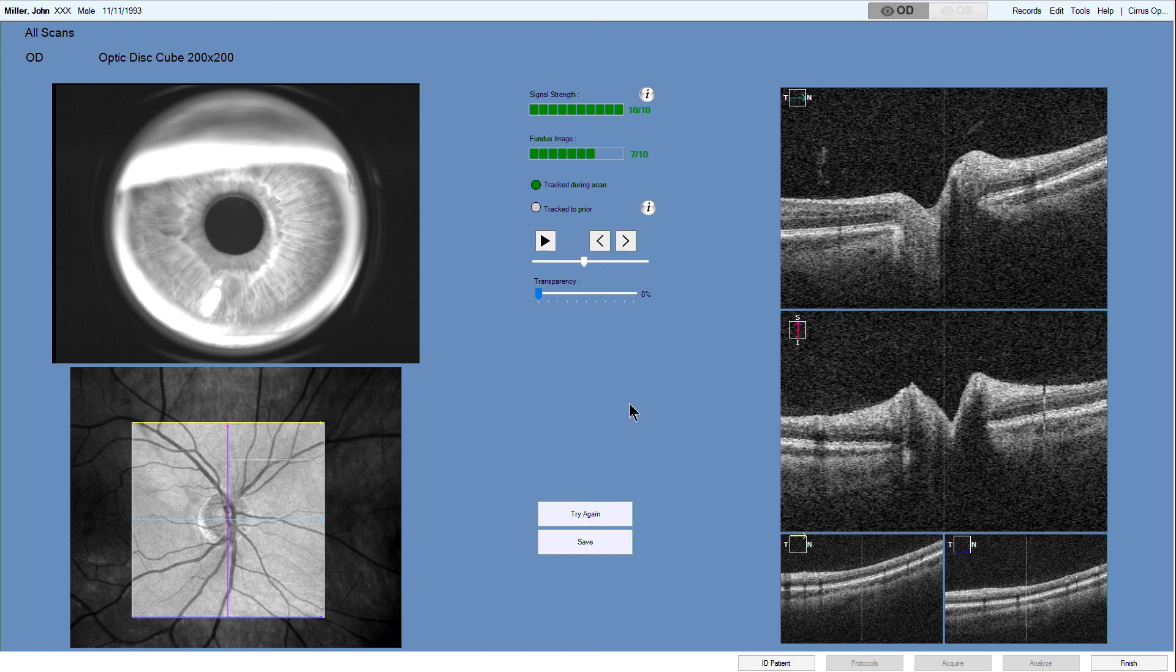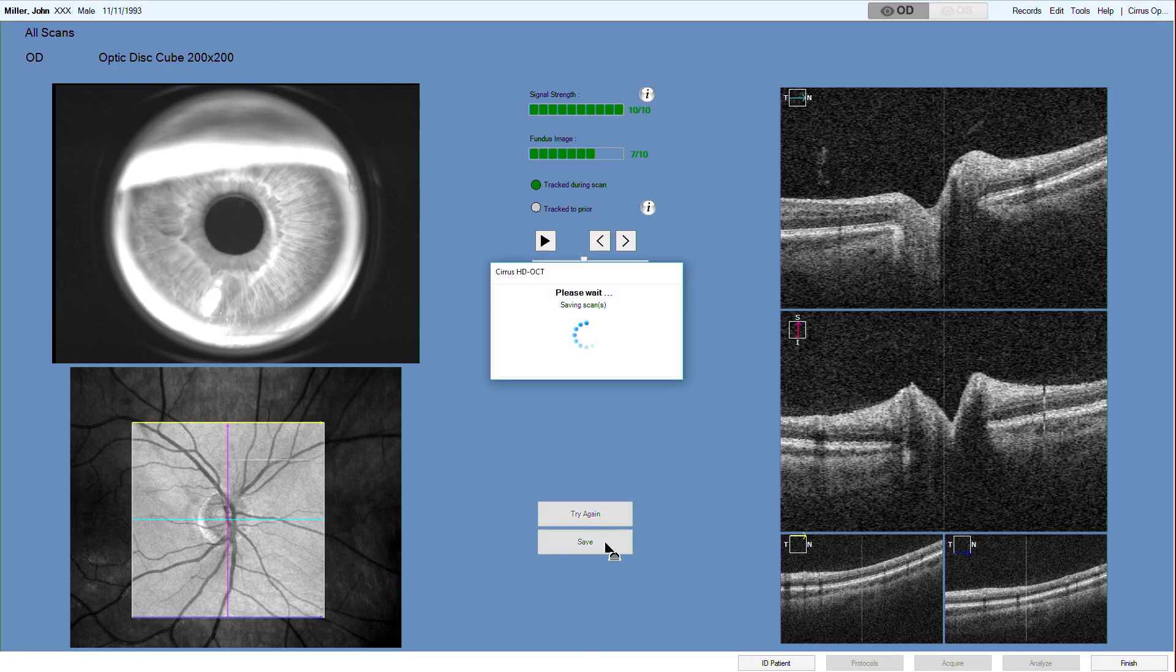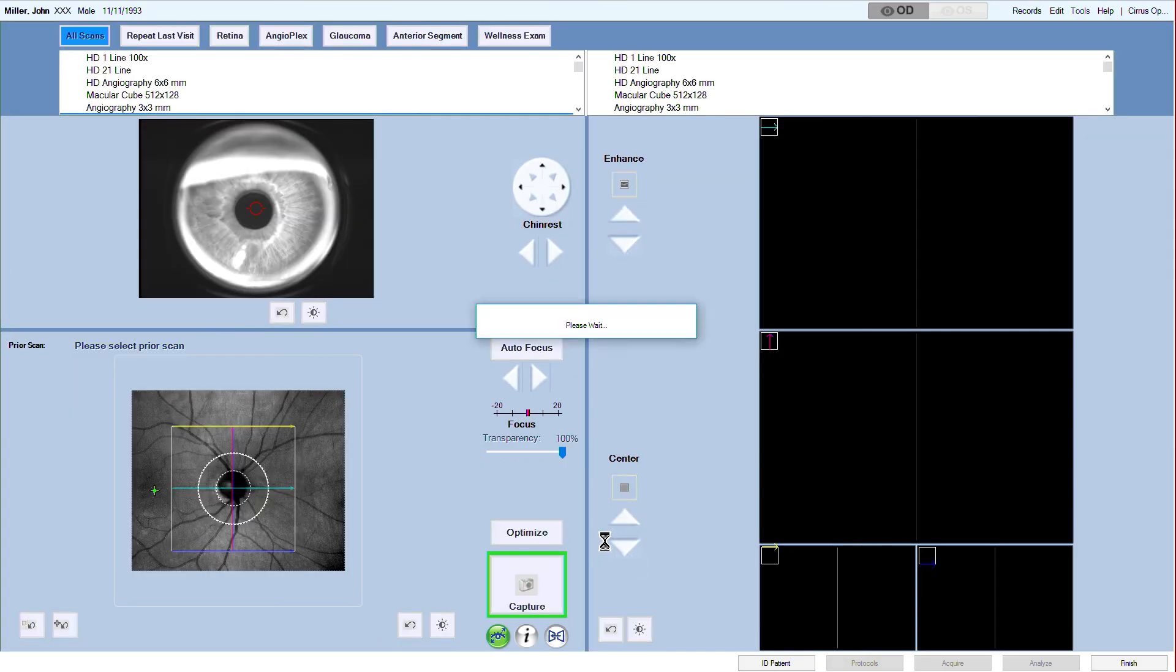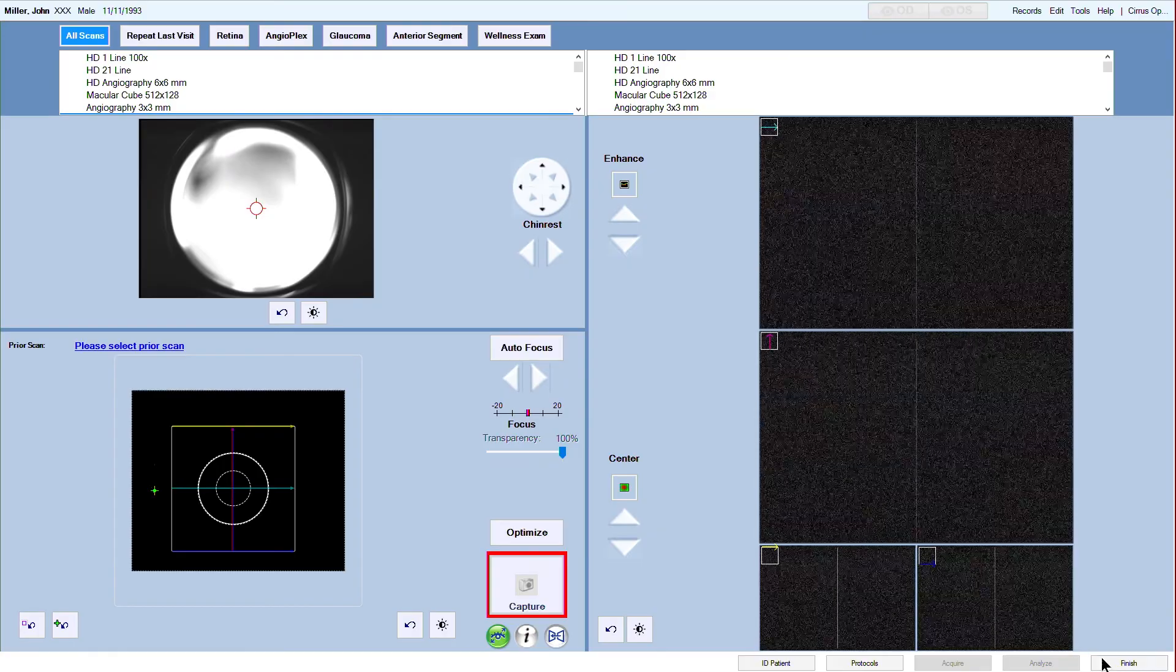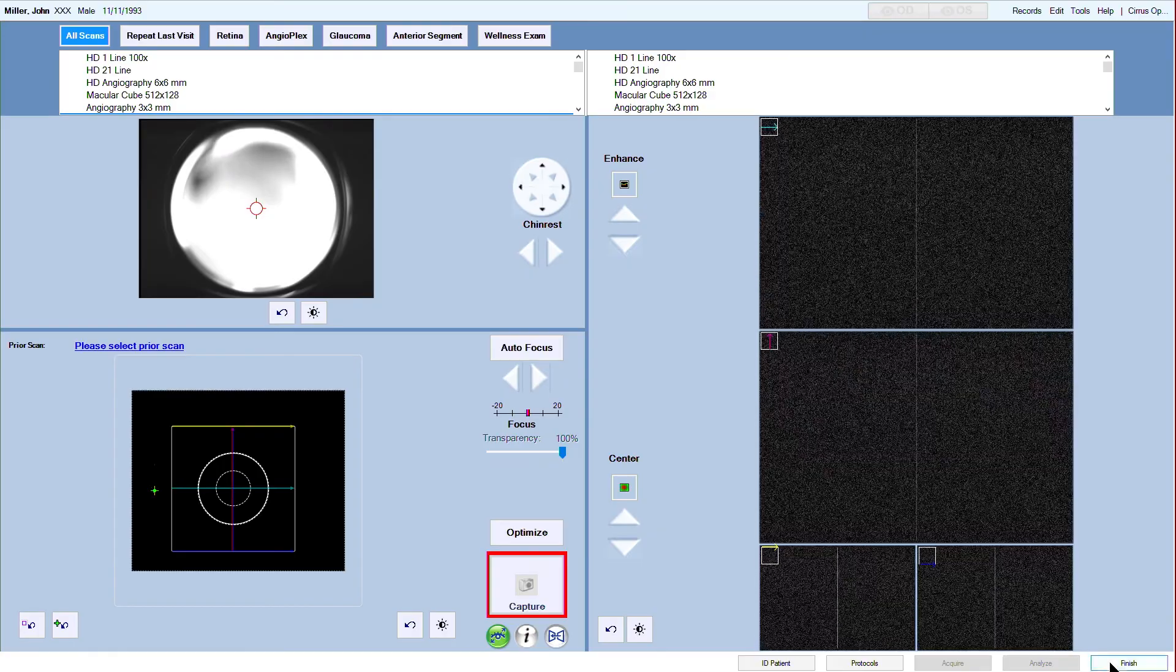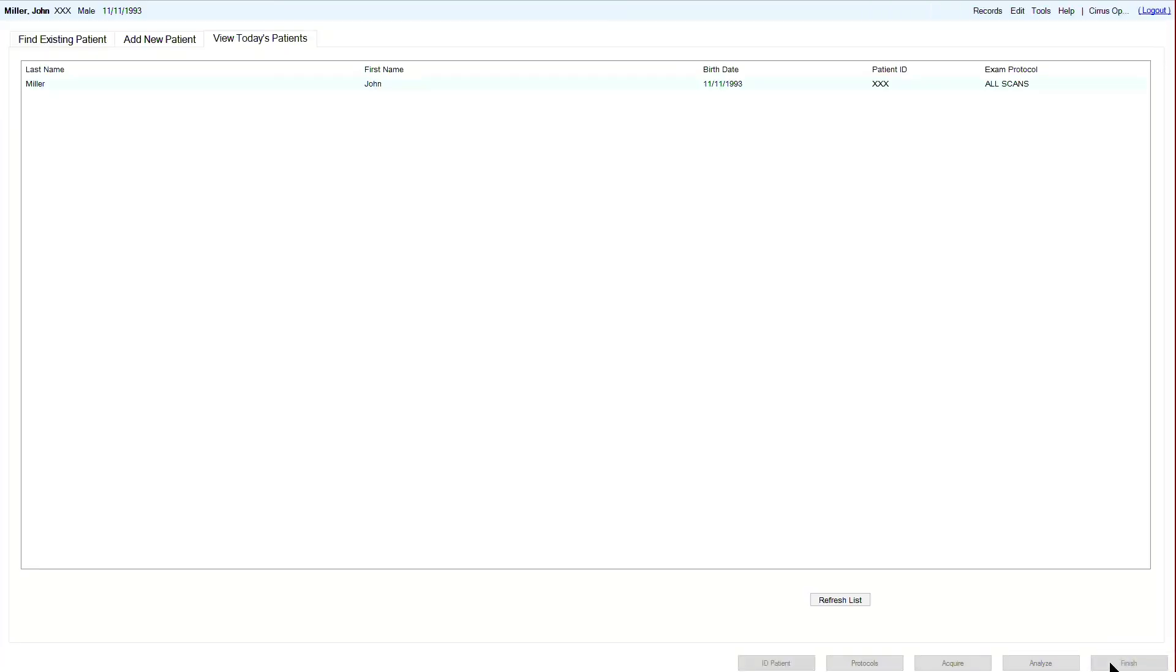After assessing the scan, save the new scan or repeat it by clicking try again. When you have finished recording, click finish to exit capture mode and you are directed back to the patient administration screen.